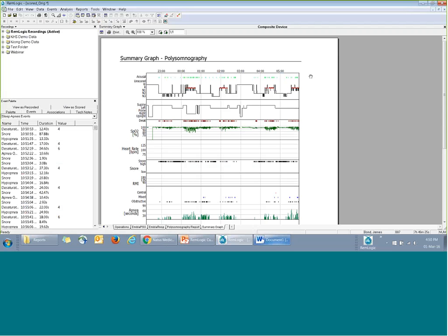Are there any questions that you may have from the floor? Please feel free to put them in the chat so that I can see and then try to answer you to my level best. I'm sure by now all of you will be able to see that you can actually do a lot more with the custom reports in RemLogic.